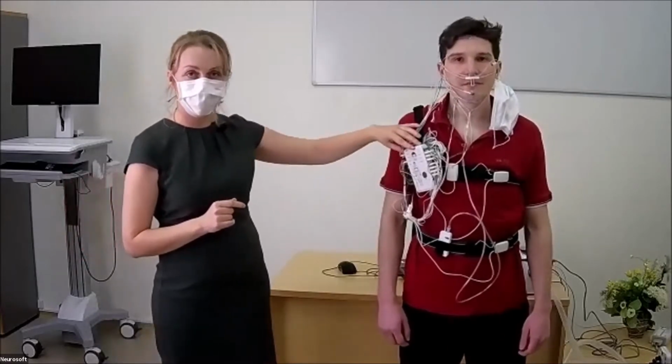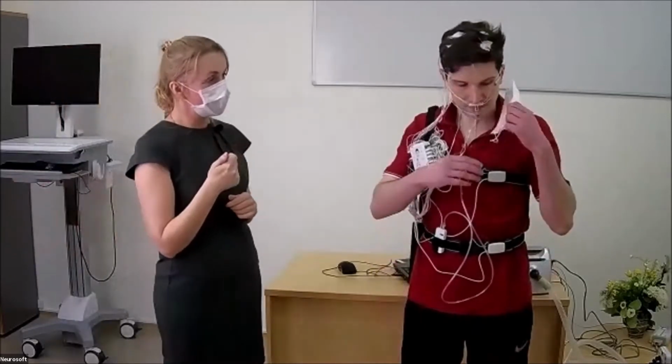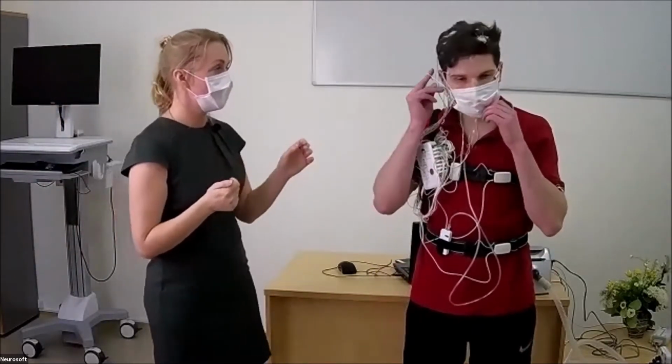The patient unit allows the patient to connect or to disconnect from our system. Now you see that we put all electrodes and sensors, but now he is disconnected from our system, and he's free to move. So I think we are ready to start our test.